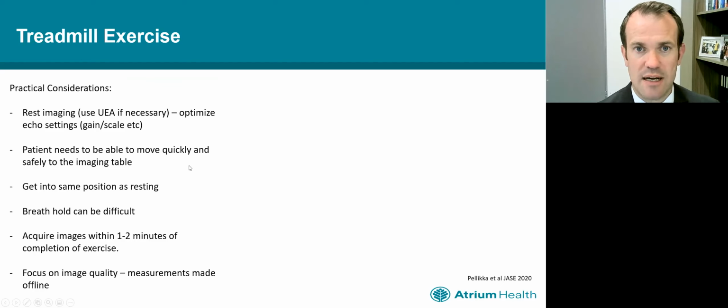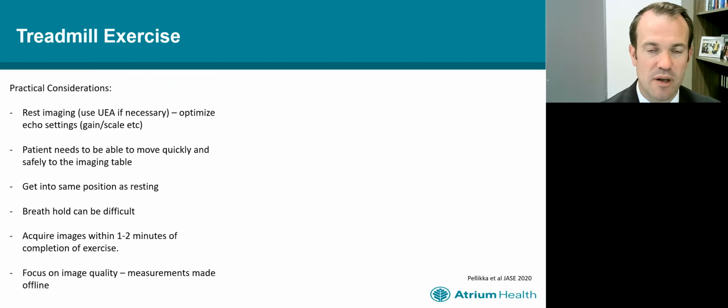And we really want to try and get them into that same position as when they're resting. If they can breath hold, great. Most of the time they can't. But we really want to try and get those images within 1 to 2 minutes, as quickly as possible, in order to be able to get that kind of peak stress.